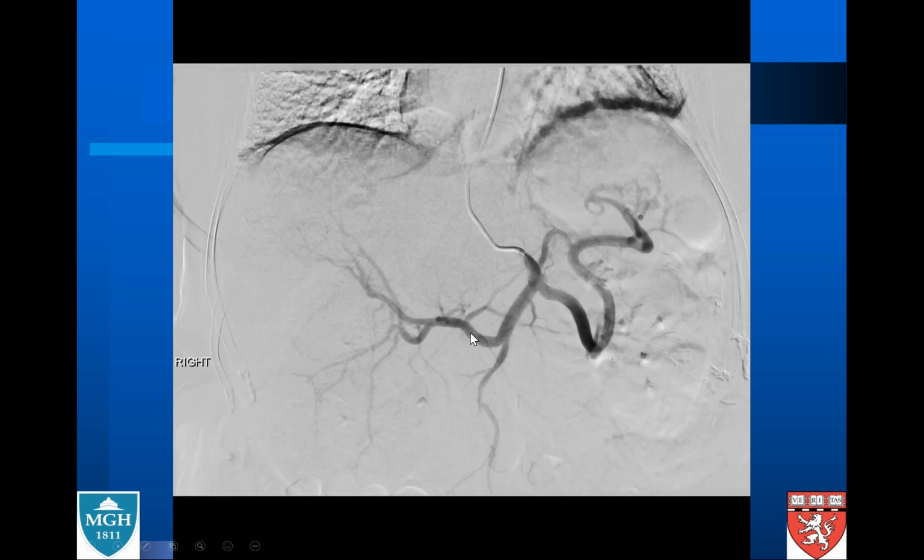If I was going to do that from a proximal administration, I'm probably going to plant my catheter about here. So I'm going to be worrying about the right gastric artery and maybe the GDA. This is a little bit older case. Now I do worry about these small supraduodenal branches that come down. So if I was going to treat whole liver, I might actually split my dose into a right lobe infusion, and in the same day, take that microcatheter out, put a new microcatheter in the left, and then inject the left lobe dose.